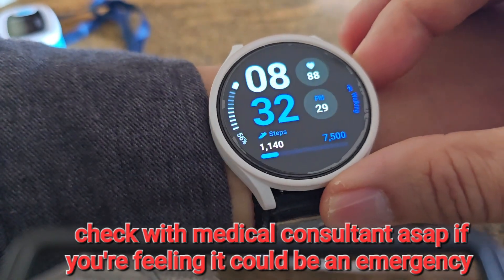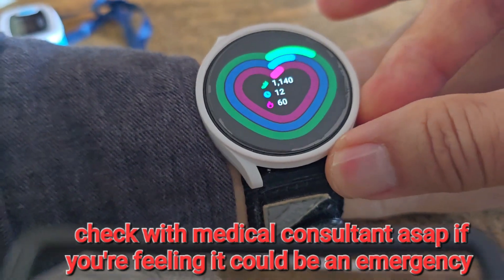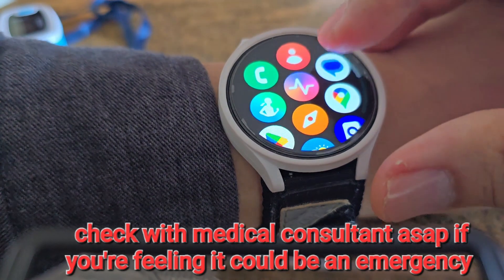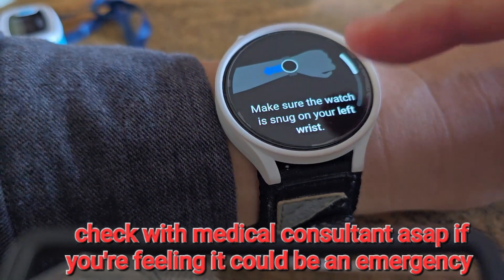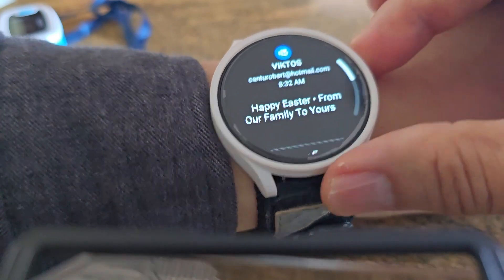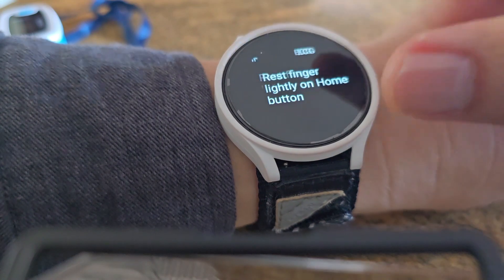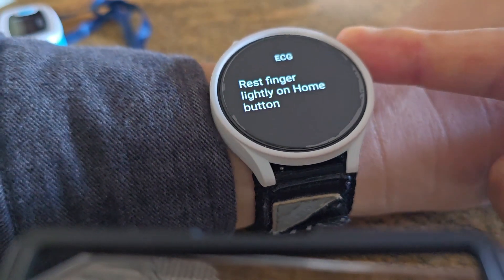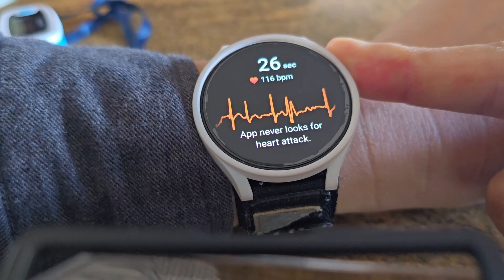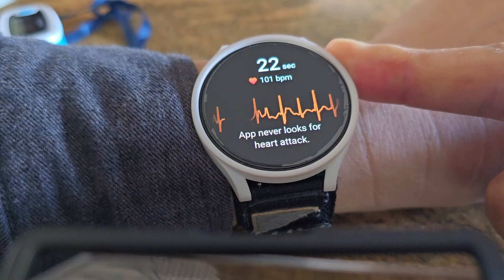To test for A-fib, you can scroll to this app — the squiggly line, which is the heart rate monitor. It says make sure it's snug. Hit okay, and now you put your finger here lightly. You don't want to touch your finger to your body — keep it separate.